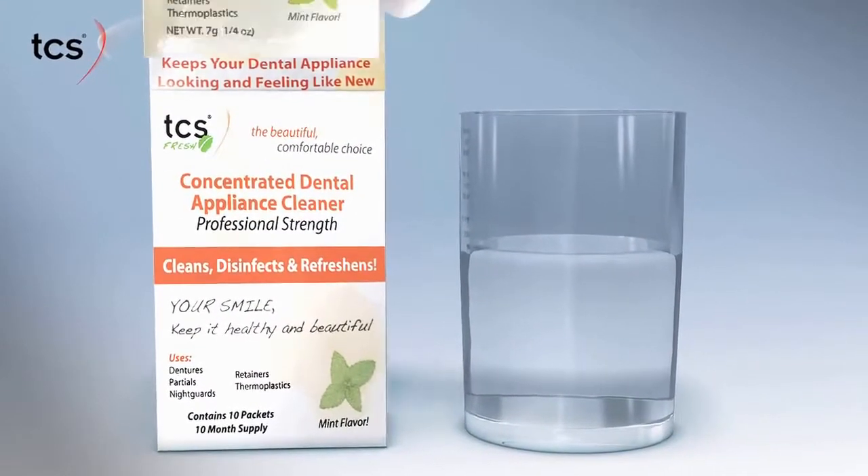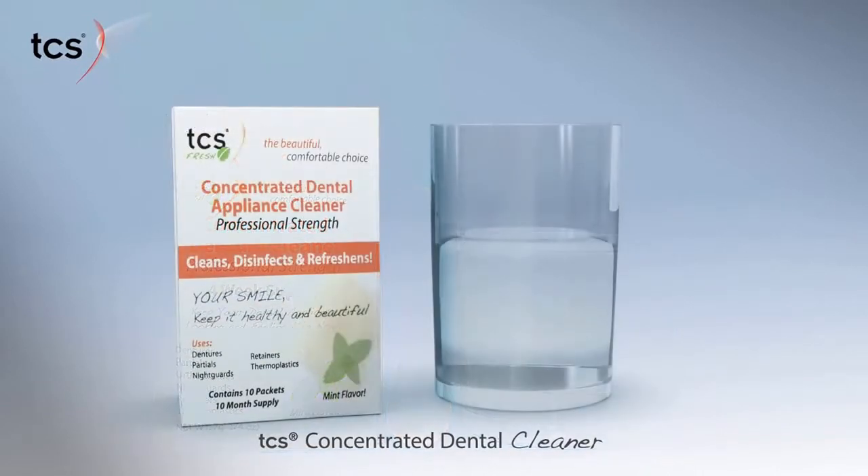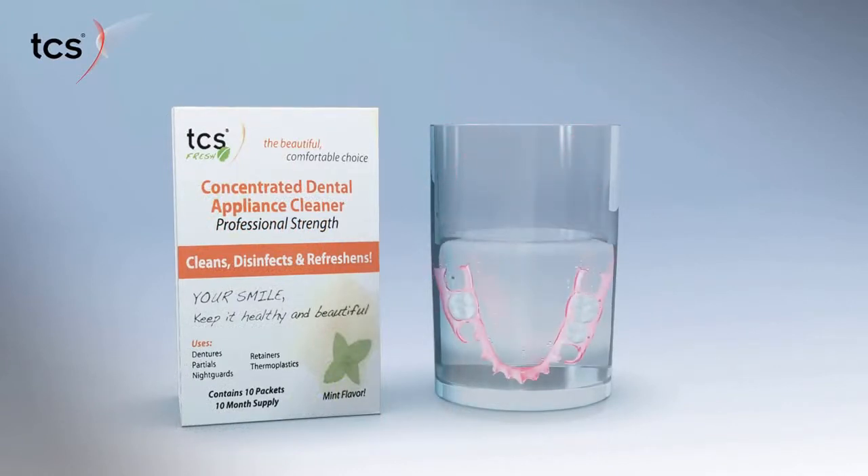TCS Flexible Partials are very easy to care for. Placing them in TCS Concentrated Denture Solution for 10 to 15 minutes a day keeps them looking and feeling like new.